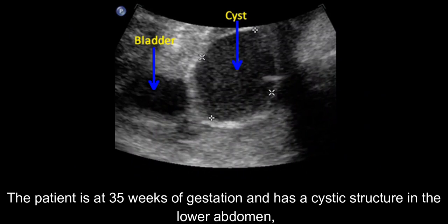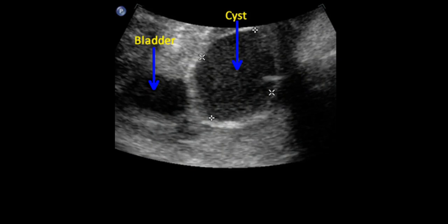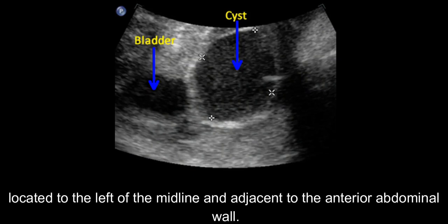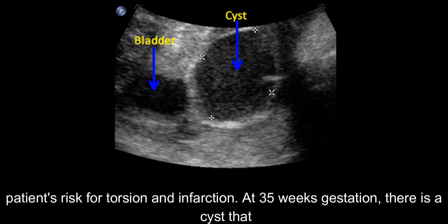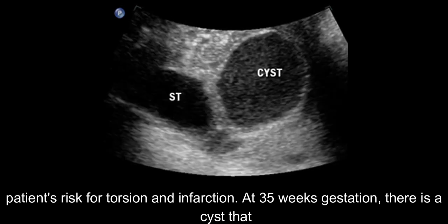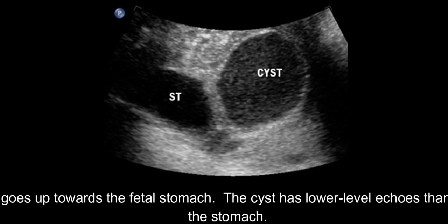The patient is at 35 weeks of gestation and has a cystic structure in the lower abdomen, located to the left of the midline and adjacent to the anterior abdominal wall. The cyst measures 45 mm x 36 mm, which exceeds critical cutoff values and increases the patient's risk for torsion and infarction. At 35 weeks gestation, there is a cyst that goes up towards the fetal stomach, with lower level echoes than the stomach.